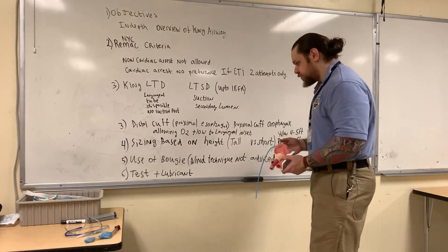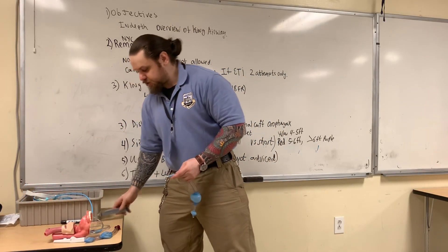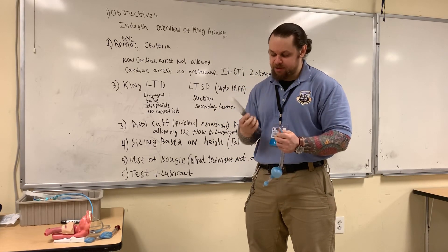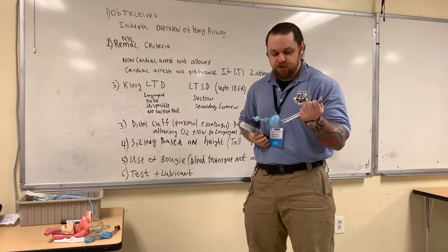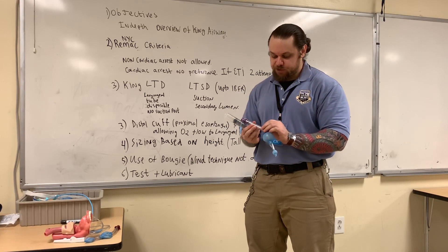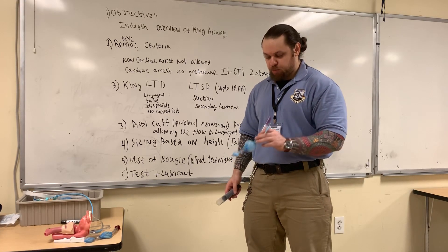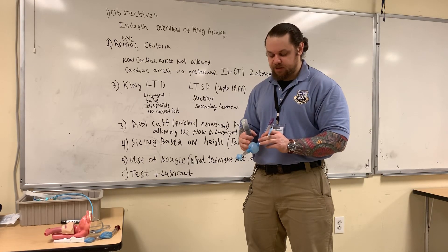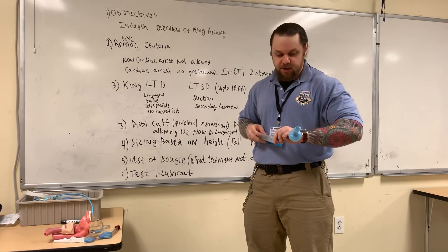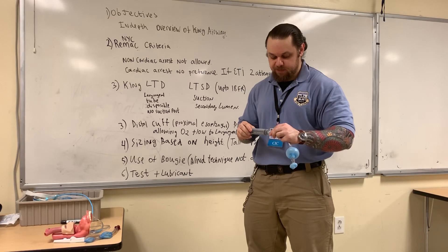The final thing I'd like to talk about is testing and lubrication. Prior to insertion, you're going to take the syringe that comes in the bag and inflate with the full 60 ml of air to inflate these cuffs. The device gives you a range between 60 and 80 ml — that range accounts for situations where you need to pull back and you hear a leak, so you may need to reinflate the cuff. You're going to inflate your cuffs, confirm there are no leaks present and they're intact, then go ahead and deflate the cuffs.